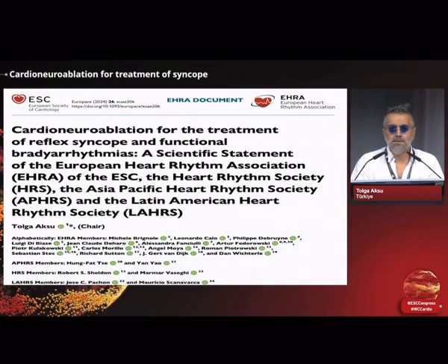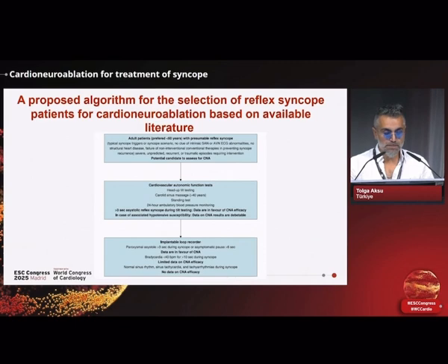Recently, we published a scientific statement about cardioneuroablation. Michael and Jean-Claude Deharo were co-authors of this publication, and we suggested such an algorithm to select our patients.